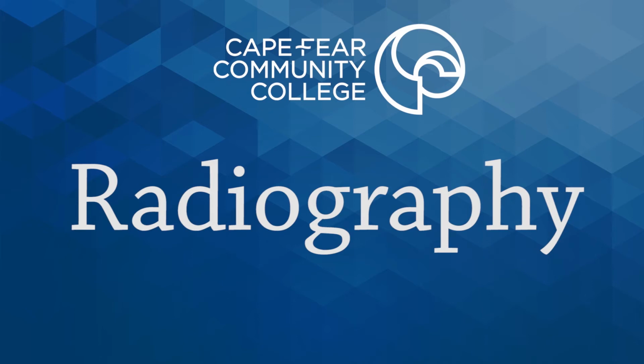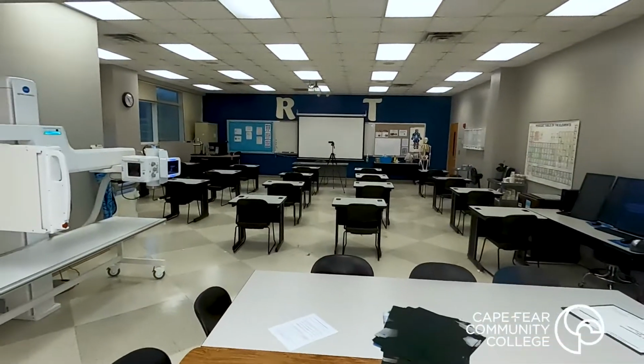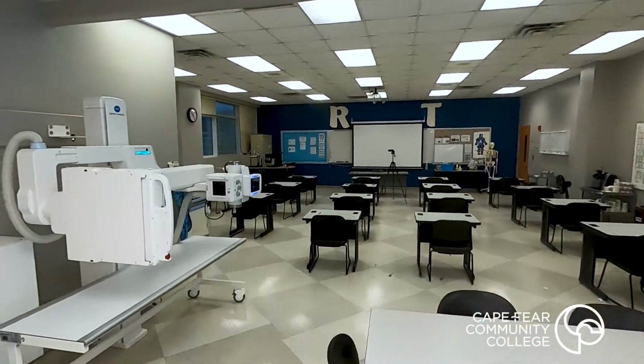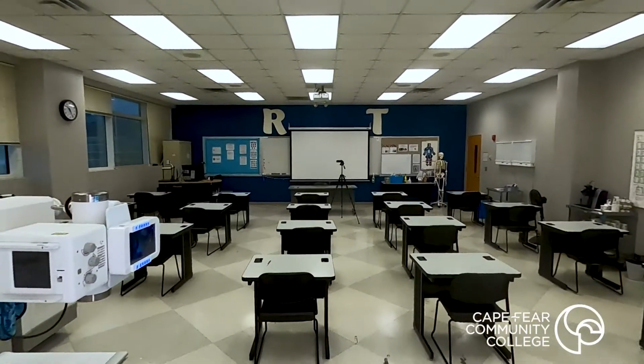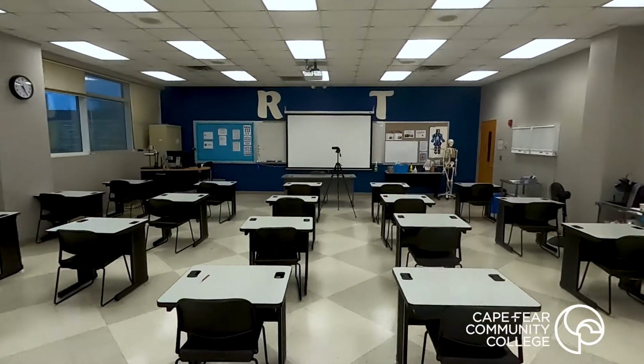Welcome to our virtual tour of the Radiography Lab. The Radiography Lab is located on the third floor of the L building. We're directly upstairs from the library on the downtown campus of Cape Fear Community College, and we're in the same building where the bookstore is located.